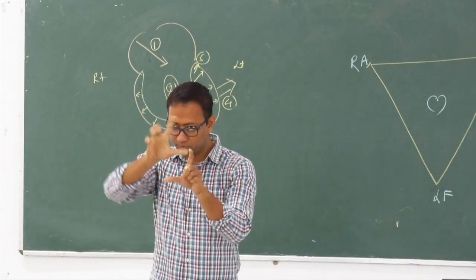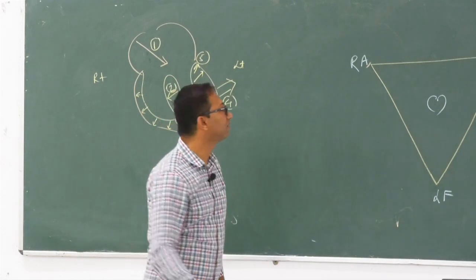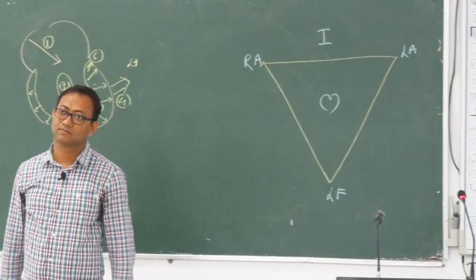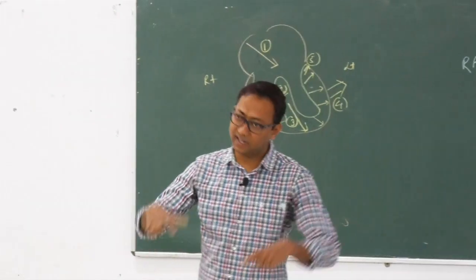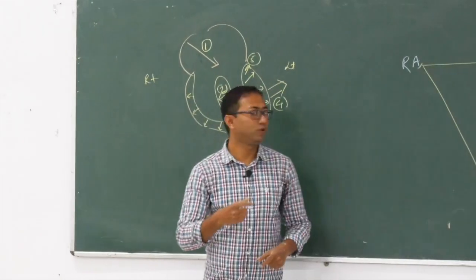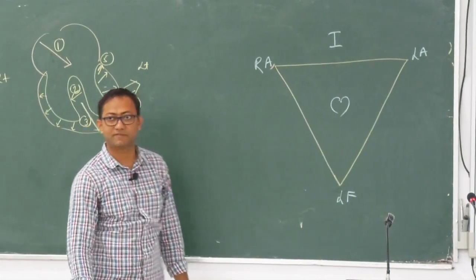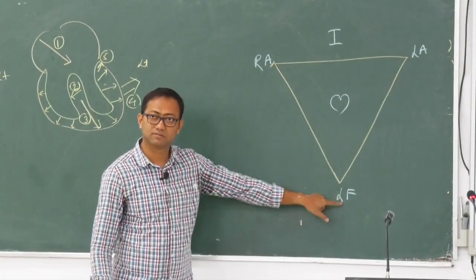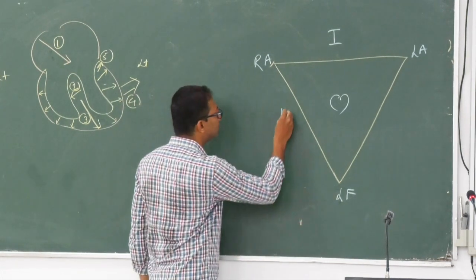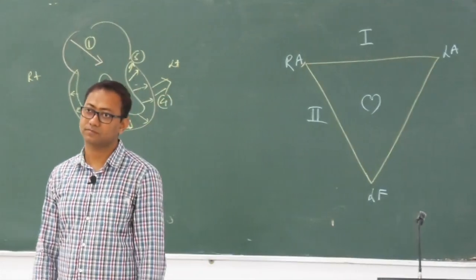Connect these 2 copper wires with the voltmeter. That will be your lead 2, right?